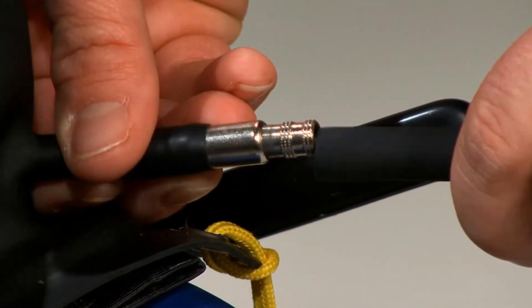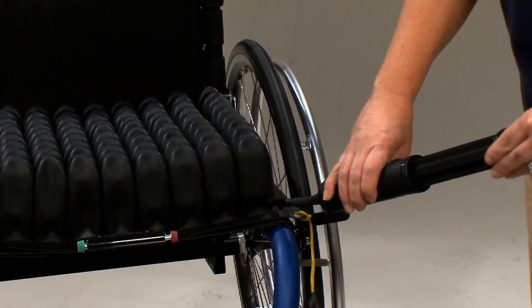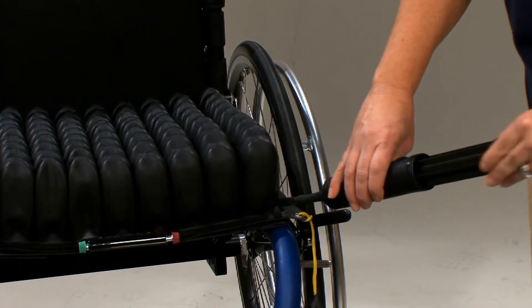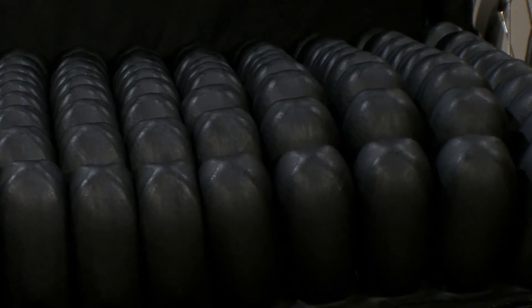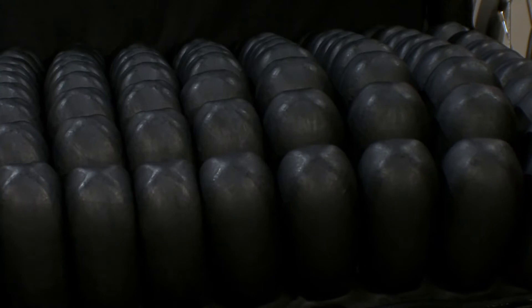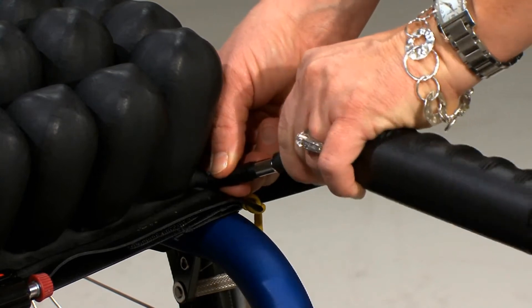Slide the pump's rubber nozzle over the air valve and inflate the cushion until it begins to slightly arch upward. Air will travel to the closest quadrant first, then pass through the Isoflow valve to inflate the other quadrants. This is why the first quadrant looks overinflated when you start the inflation process. Pinch the pump's nozzle and turn the air valve clockwise to close, then remove the pump.